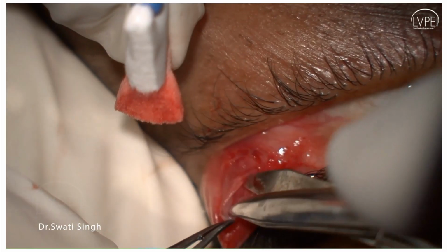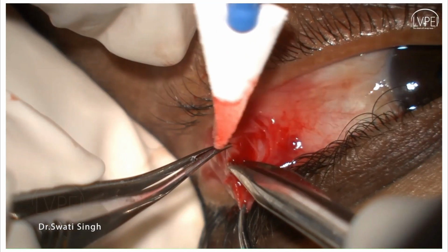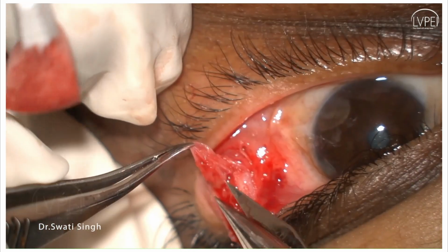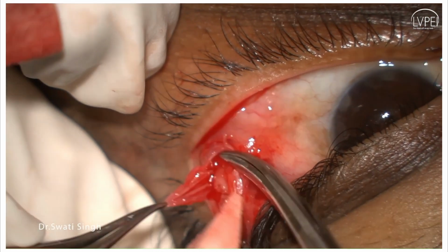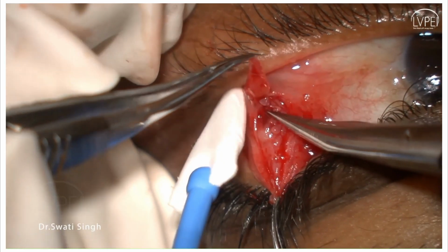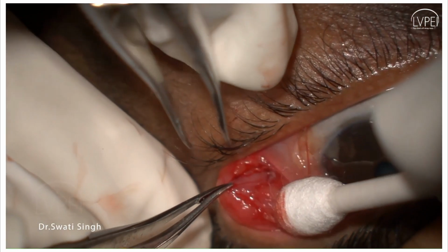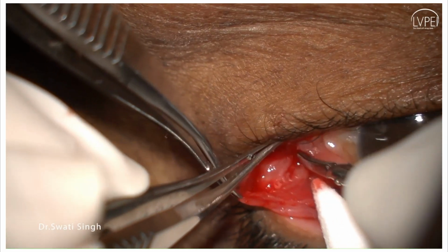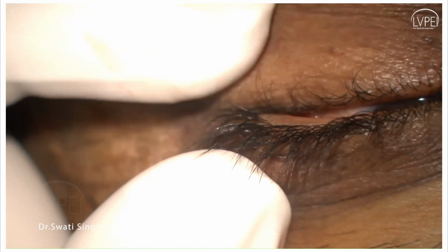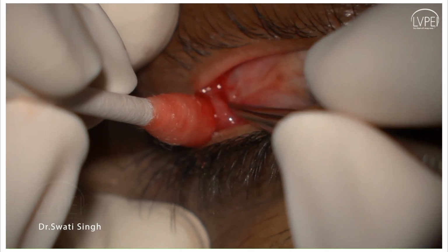Following this, the cyst wall is meticulously separated from all the surrounding soft tissue. The cyst wall is then completely excised, making sure not to damage any of the functional lacrimal gland ductules. The overlying conjunctiva is then apposed using tissue glue.